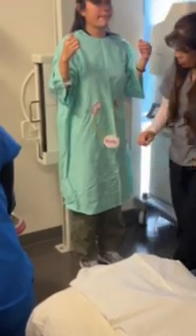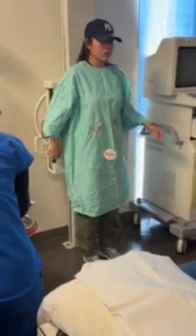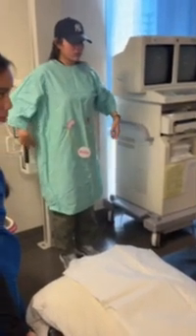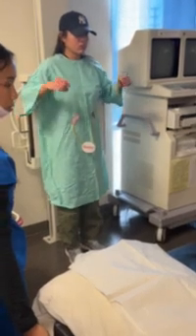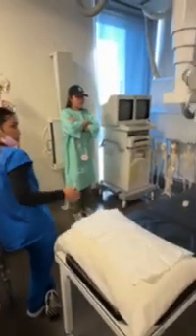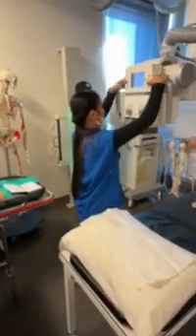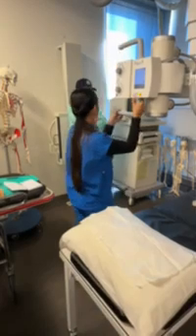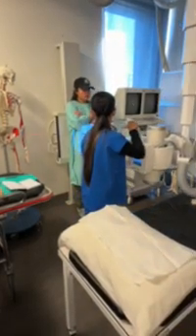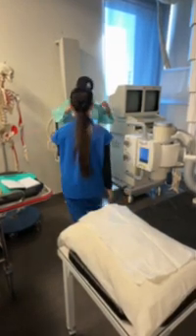Okay. So I'm gonna use my tube, center to the Bucky. What is gonna be my SID? Can you hold that? 40. Center for me at the iliac crest. So 40 SID, okay? Can you see it there?